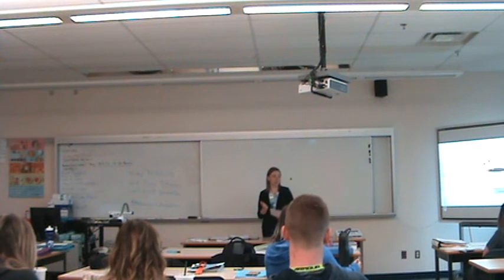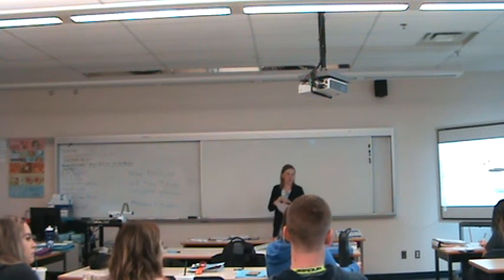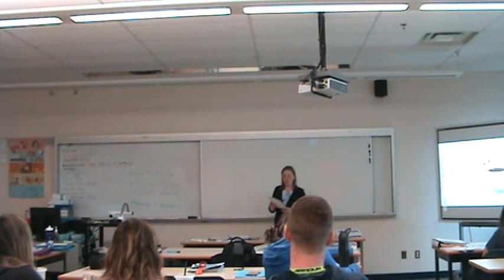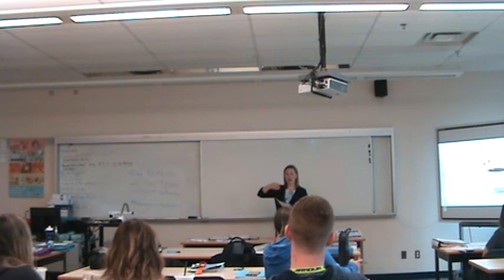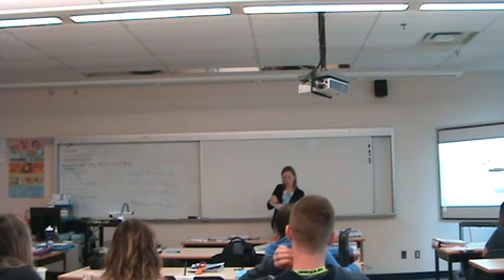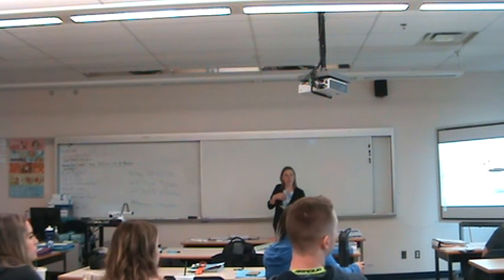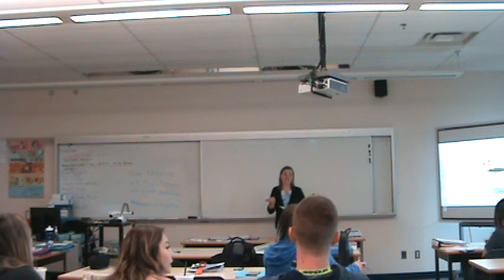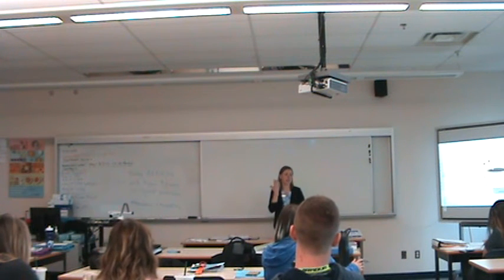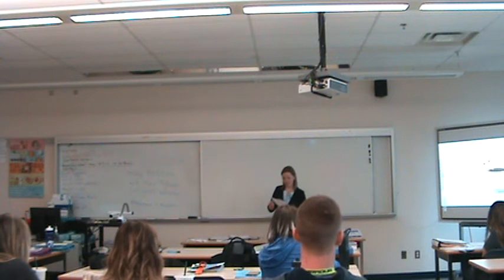And what's another reason it could be? The normalization process. Yeah, that's kind of the undesirable tooth movement part. I would say that all belongs in there. But how about a loose band coming up? Oh, it's pokey, it's irritating, but I'm looking for something else. Coming up and getting all dirty, and then damage to the tissues. Yeah, damage to the tissues, damage to the teeth. What I have here is to prevent decay, but it could also be to prevent damage to your tissues as well, because it's rocking and moving, and that's not good.